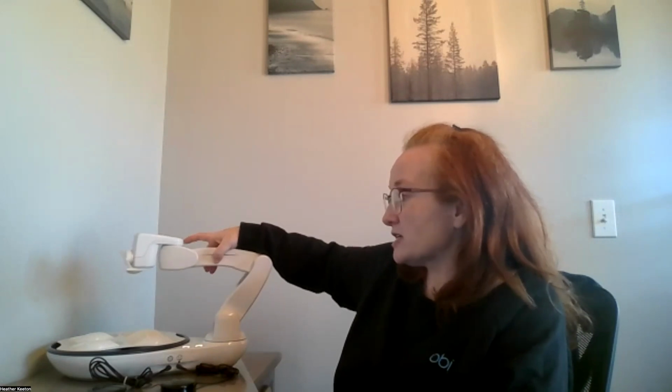Teaching is one of the hardest things. I'm actually going to leave it on this angle. So when I press the teach, you will notice Obi goes to this neutral position. So you do need to wait about 3 seconds until it's in this position. On the base, the power button and the teach button will both be lit up. When you go to grab this, there's actually a ring here, so that way you know where to put your finger or your thumb. For me, it's easiest with my thumb because as soon as you touch this, it releases all the motors. You can kind of make it do the worm or something. It releases all the motors, and that often startles people.